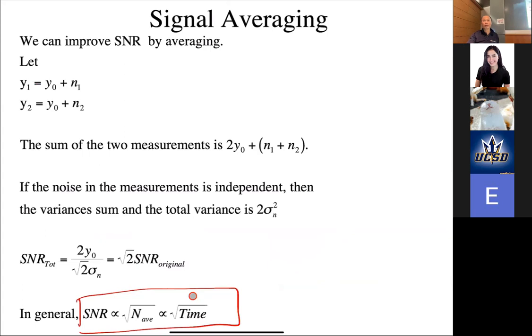4 times, right? Yeah. So SNR is really expensive, right? So if I'm losing half my SNR due to a problem, I've just made my life 4 times as difficult, right? Not just twice as difficult, 4 times, okay? So that's why it's really important to look at SNR. SNR is very expensive from a point of view of time. If you assume that time is linear to money, then that's why it's expensive, right?